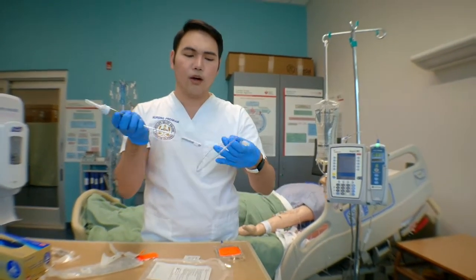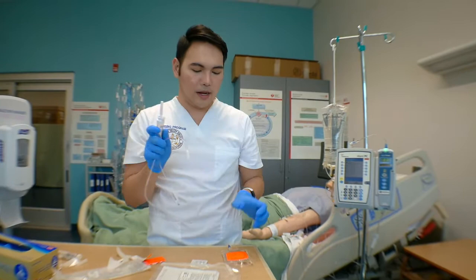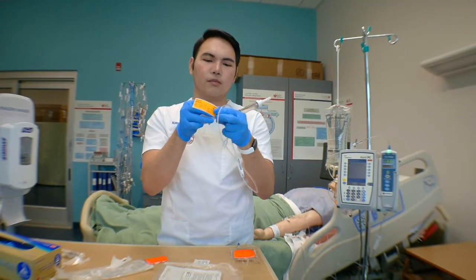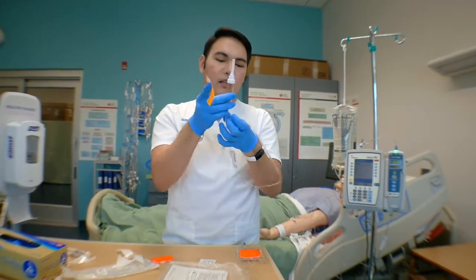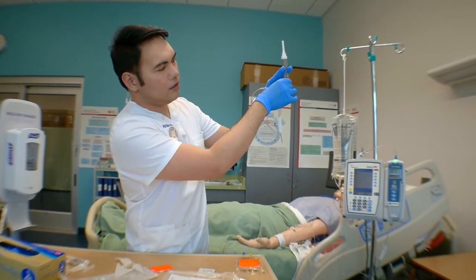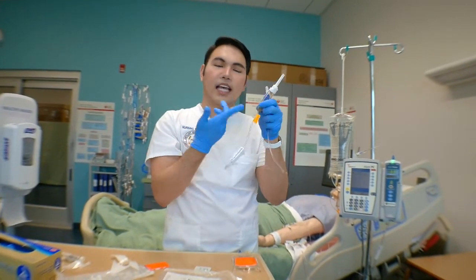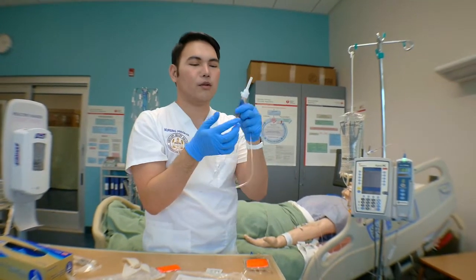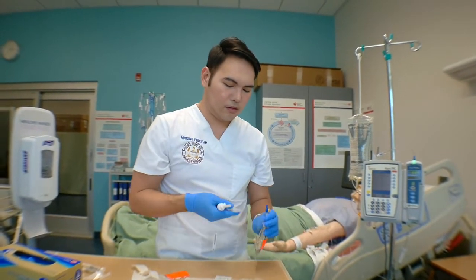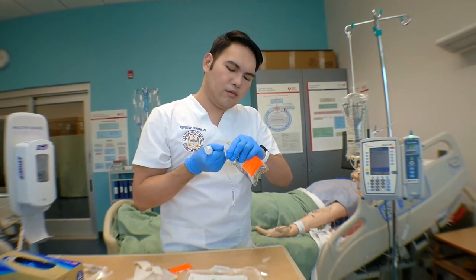So, like the one that we did for the primary, we're also going to prime this antibiotic. So I've already made a label, so I don't forget. I always put it on the tubing already, even before I prime it. So like again, I usually put it here. I put the date, the time, and my initials. 72 hours also for secondary tubings. So I'm going to snap.